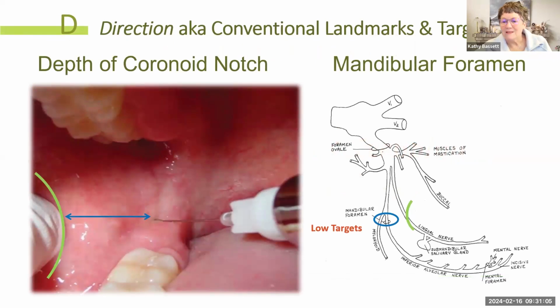So most of us can recite this description for an inferior alveolar nerve block in our sleep. Number 1, place your thumb or finger in the depth of the coronoid notch. Insert the needle adjacent to the pterygomandibular fold at a height parallel to the middle of your retraction finger. I'm kind of surprised there isn't a dental rap song for that.